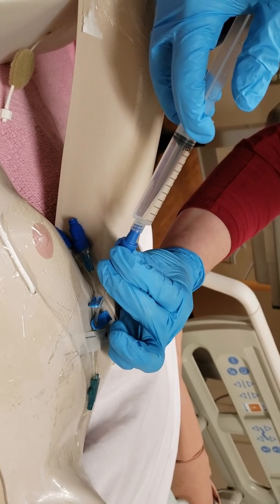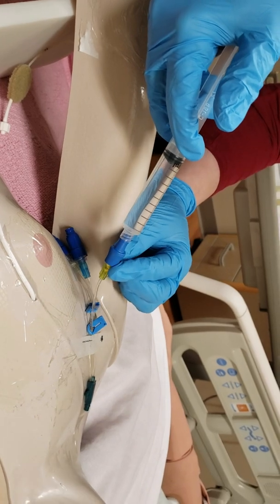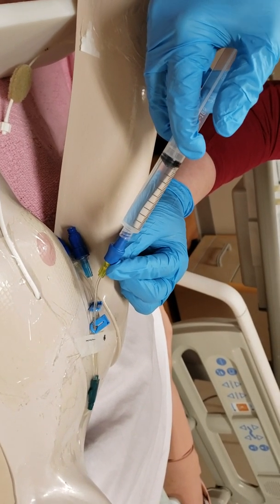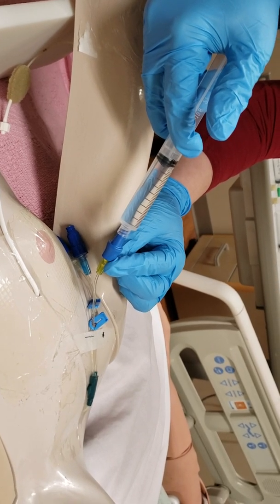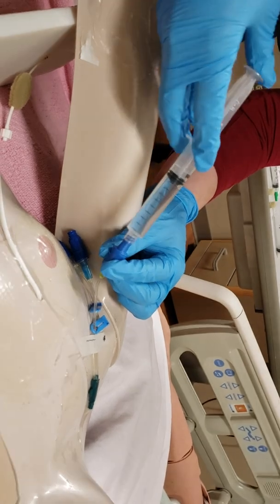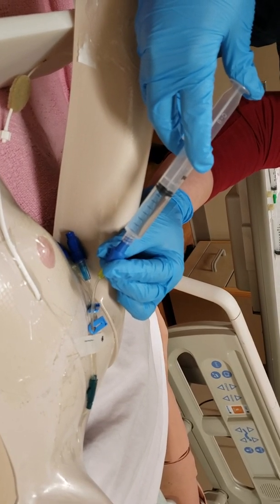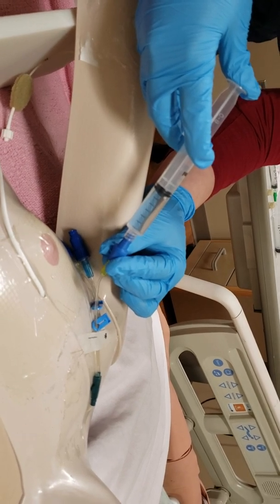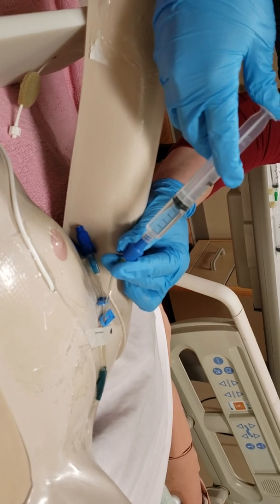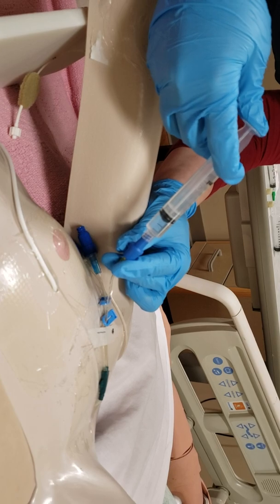And this one, the first half of my flush, I'm going to give at the same rate that I did my medication, which was over 2 minutes. Still talking to Mary, making sure. So once I've got to the halfway mark, and that's been about 2 minutes, the last half I'm going to do in a pulsating manner.